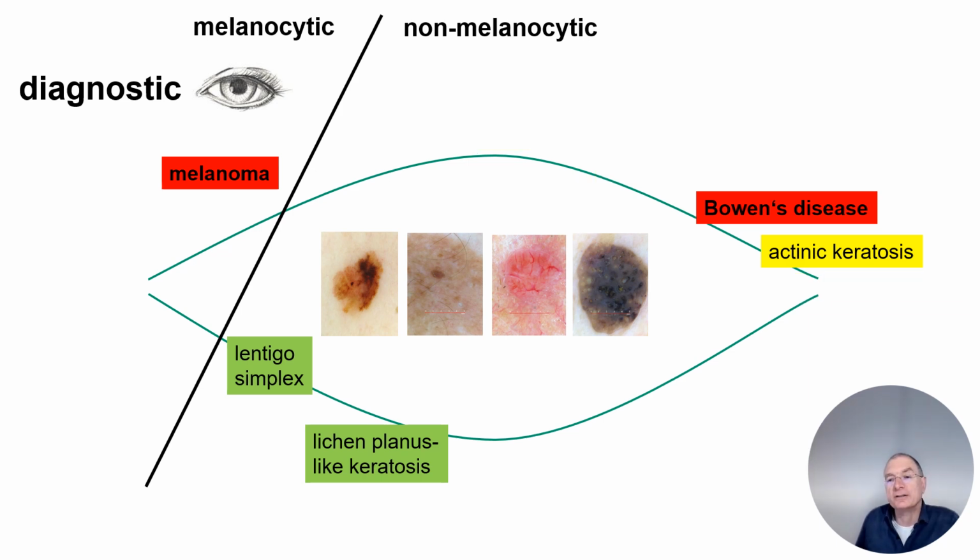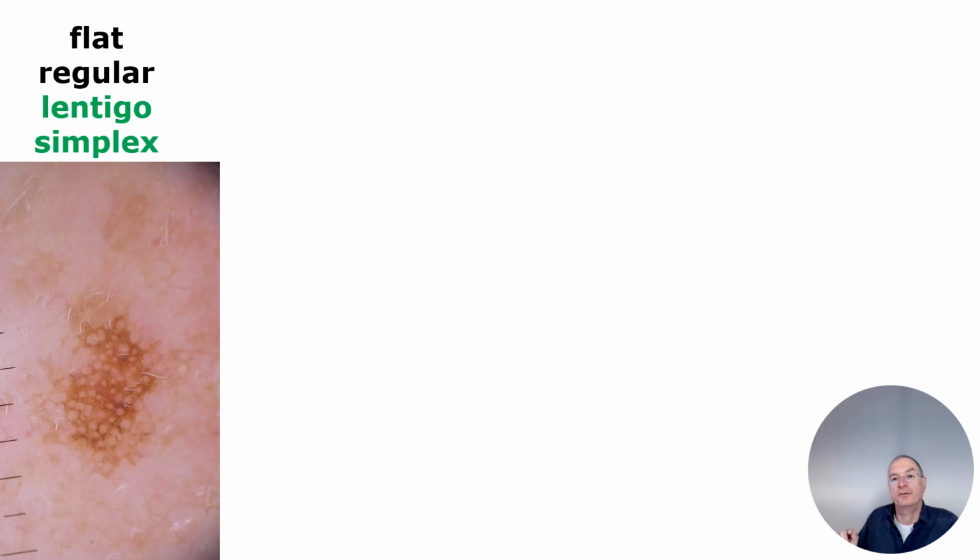So important is to detect melanoma at a very early stage. This is the most important thing, and we have here some different typical diagnoses in which we can learn when we are comparing. And when I use my dermoscope in the head and face area, before I use it, I touch the lesion with my finger, and this knowledge I want to share with you. Flat, regular, and flat in touching.